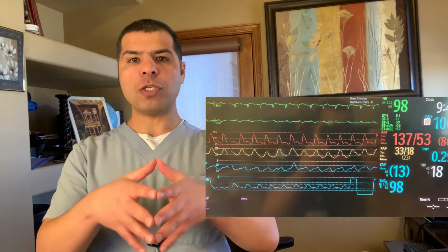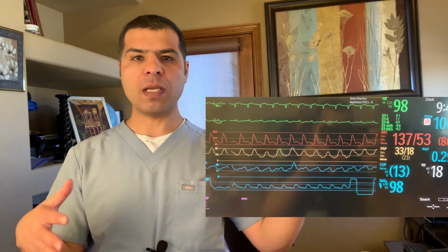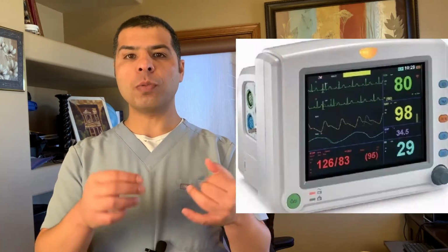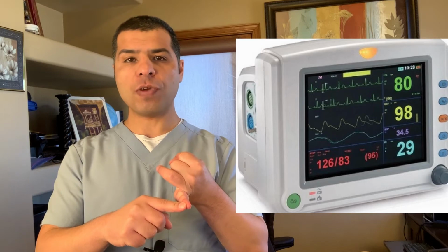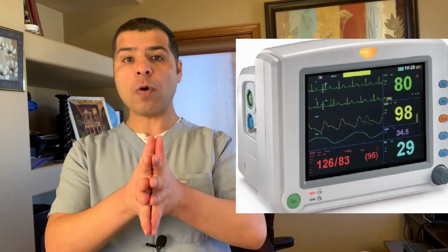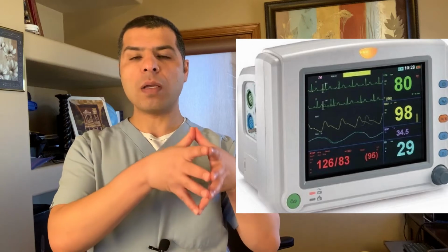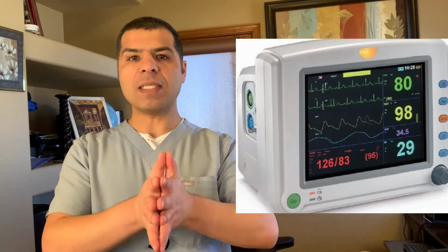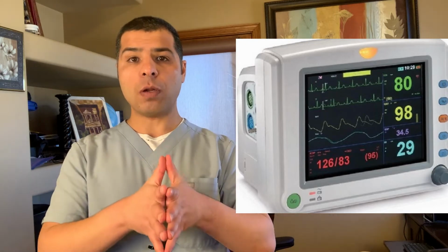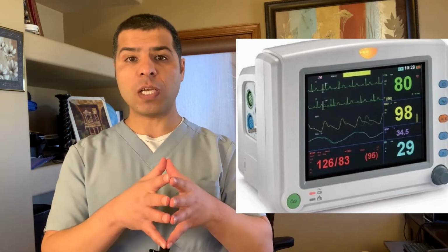Next, make sure he's on a monitor. The patient in the ICU was automatically placed on a monitor. But let's say we kept him on the floor. Make sure to immediately put him on the monitor. You monitor his oxygen saturation, very important, his heart rate, rhythm, and blood pressure. From now on, you need to keep your eye on the monitor, or at least assign someone to update you on any changes on the monitor, specifically oxygen saturation.